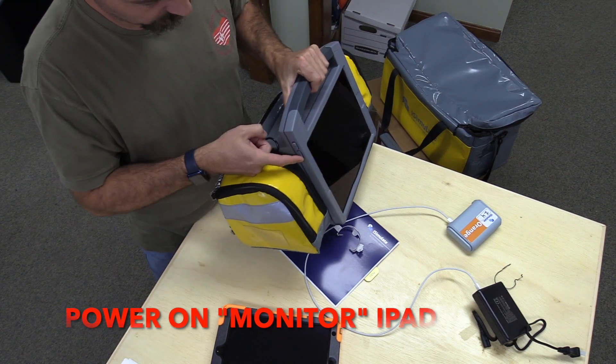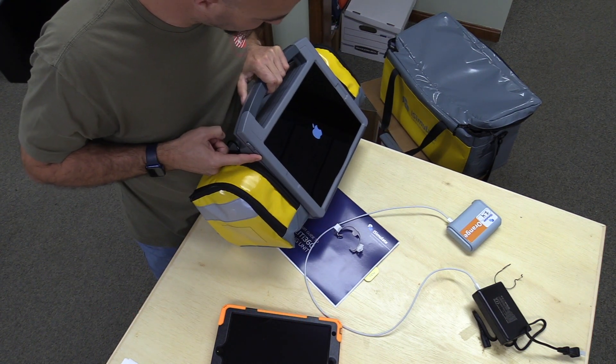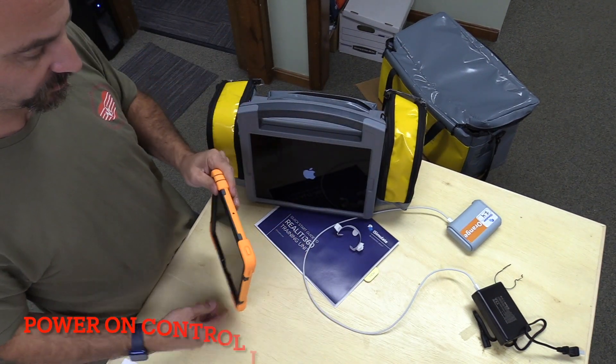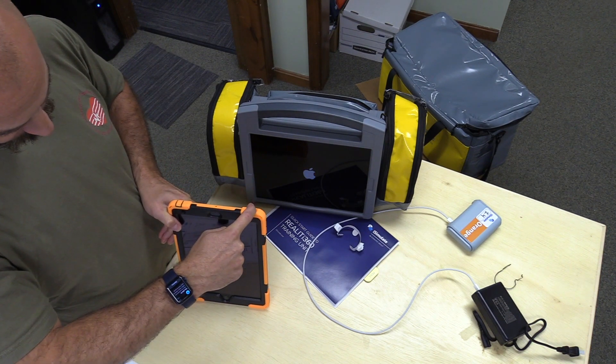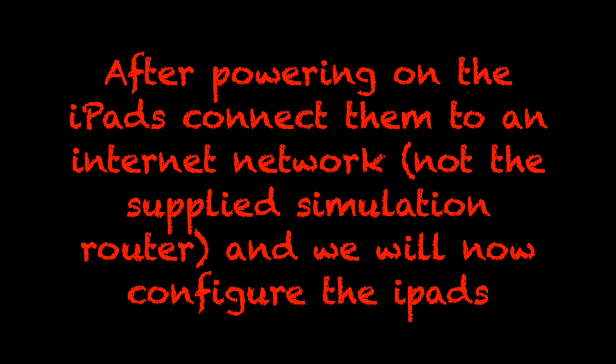To power on the monitor, there's a small switch on the left side of the case as you're facing the iPad, which you'll press and hold until the Apple screen shows up. Power on the control iPad using the button on the top right of the control iPad, again until the Apple icon shows up.